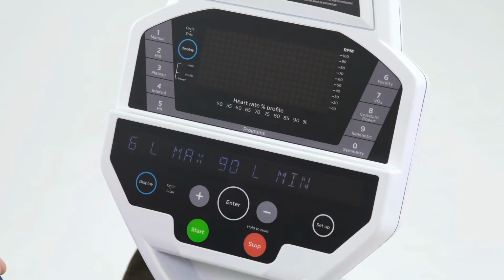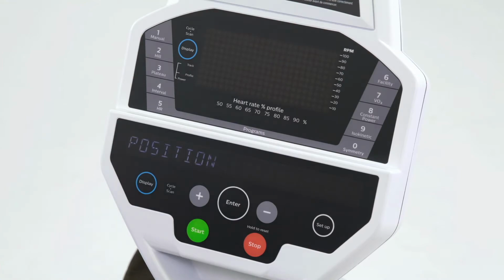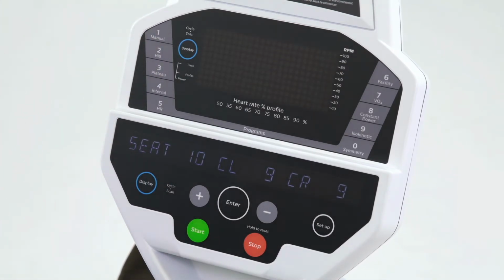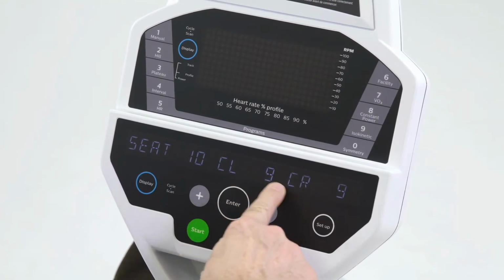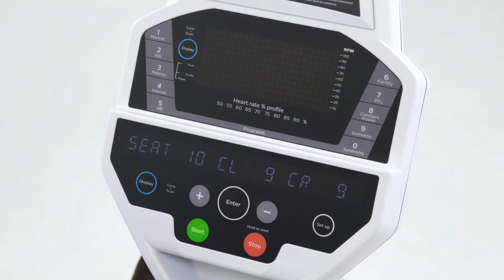So this patient has a functional range of 80 degrees, and what we're able to do now is calculate what this patient's seat position should be based on the height we entered, and what the crank position should be based on the patient's range of motion. So the seat should be set at 10, which we could set, and then the left crank would be set to 9, right crank set to 9. So you go down and set the crank to position 9, and then that will allow the patient to go through 90 degrees to 10 degrees. 90 degrees here, 10 degrees here.